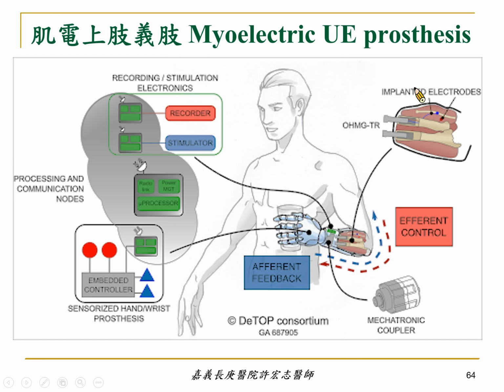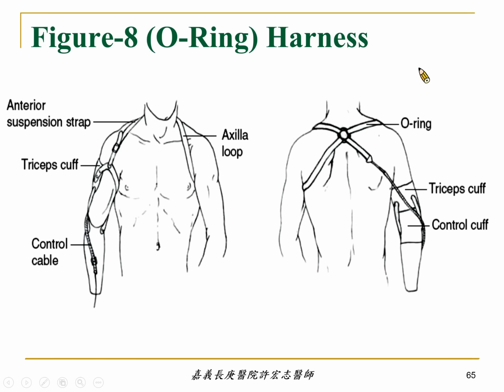Actually, we spend a lot of time training persons with upper limb deficiency to use their myoelectric prosthesis during our clinic. You can see this patient is performing very well with the myoelectric hand due to the advanced technologies. You can do some fine movements like rolling the keys, opening the doors, even folding the pages. We call that the myoelectric hand.